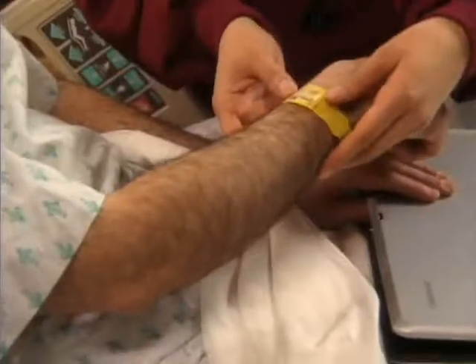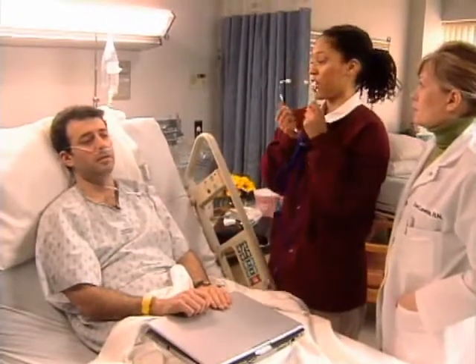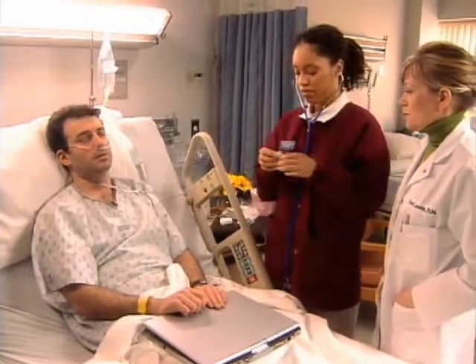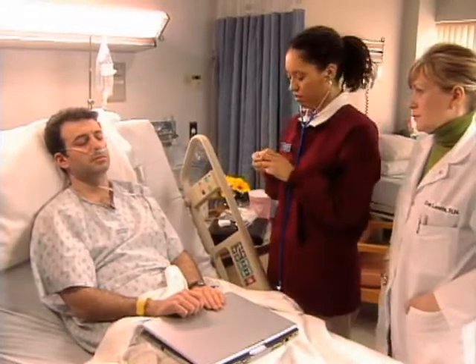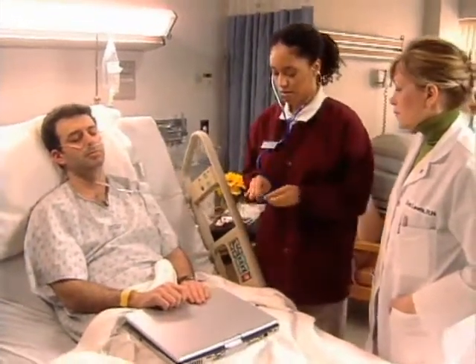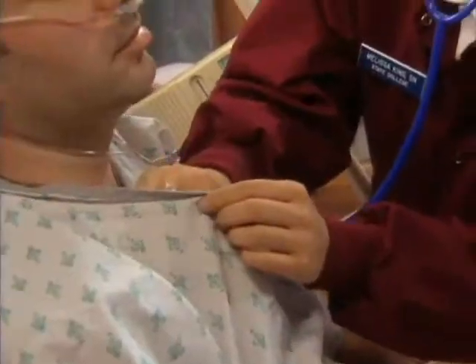Okay. I'm going to check your ID band. Can you tell me your name? Robert Simon. Okay. I'm going to listen to your chest. Is that okay? Down for a minute. Just take some deep breaths, if you can.